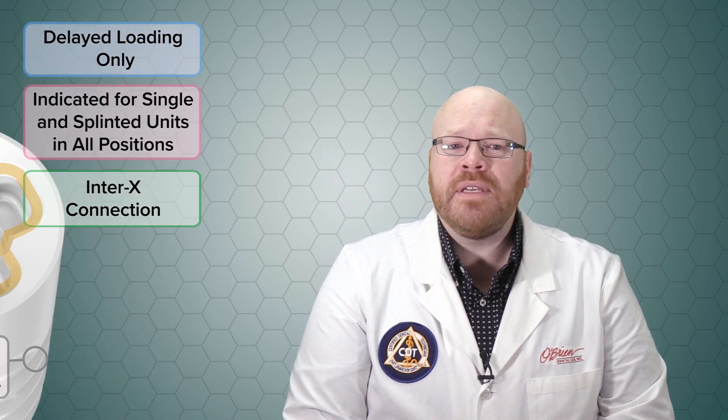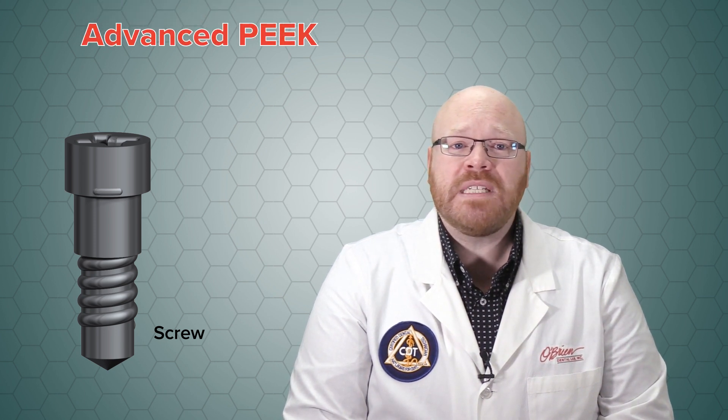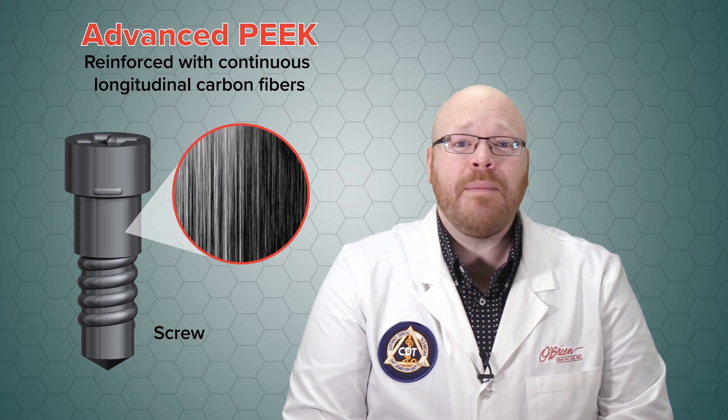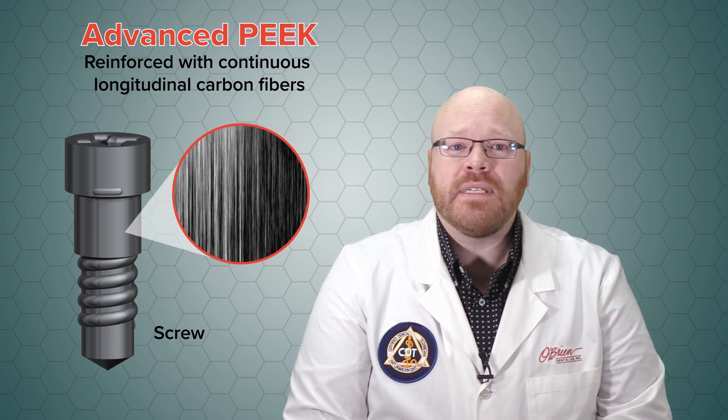One thing that you'll notice quickly about these components is the screw. It's got a very different look and feel from a typical metal screw and it really looks like a plastic imitation screw. In reality though, these screws are made of an advanced PEEK material that's been reinforced with continuous longitudinal carbon fibers that make them highly resistant to tensile forces.